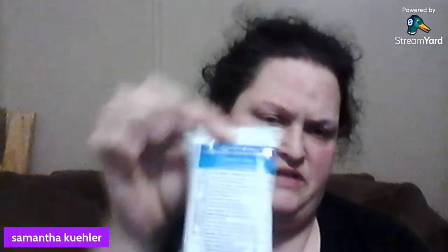They come in a box, and each box has little packets that look like this. You pop that bad boy open. There's 5 of these little tubes. I've got 2 left from this package. And we just pull one off. So that's what I'm using. Put the other one back in the baggie. All right, and so now we have our little tube.